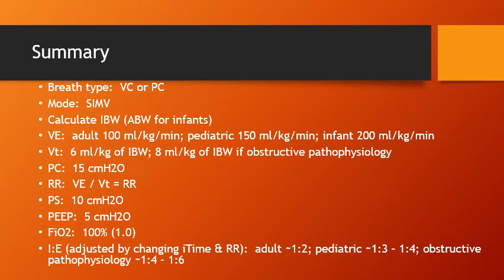If we're in SIMV mode, we need to set a pressure support, and that's always going to be 10 centimeters of water. And then for all of our patients, we're going to start out with a PEEP of 5 centimeters of water and an FiO2 of 100% or 1.0.